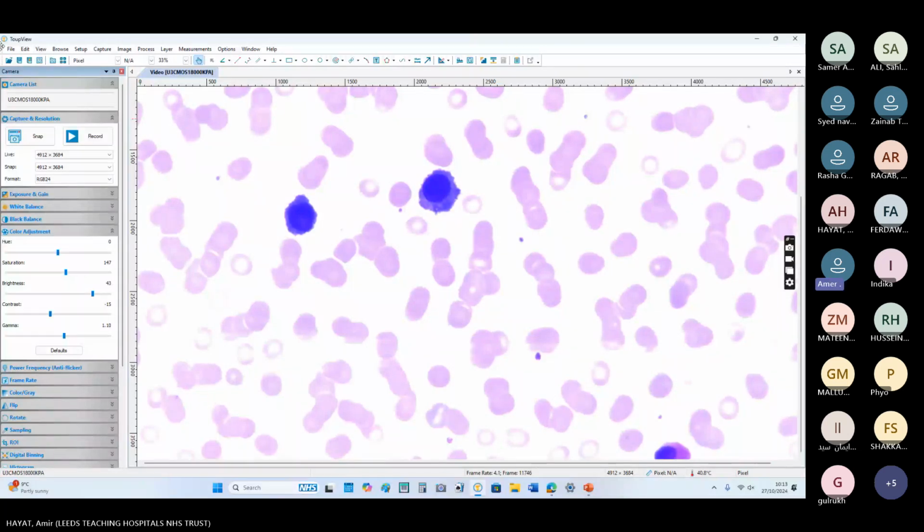Yes, in general, according to the IMWG definition of plasma cell leukemia, if the plasma cells are more than 5% in the peripheral blood, you call it plasma cell leukemia. But this patient already has a diagnosis of multiple myeloma, and flow cytometry shows he has CD56 positive with other myeloma flow cytometry.